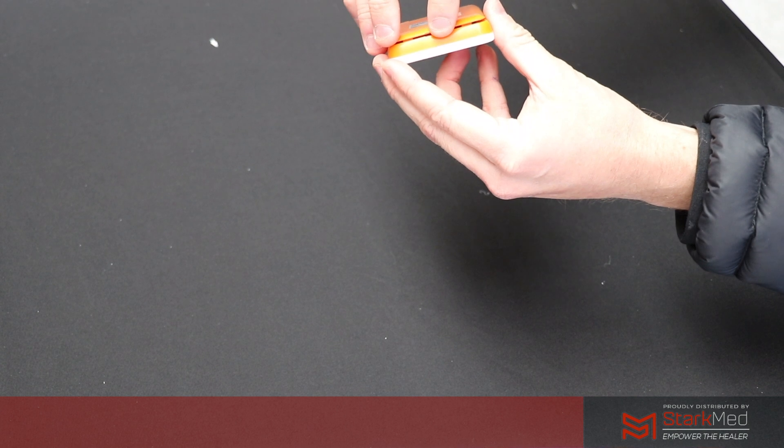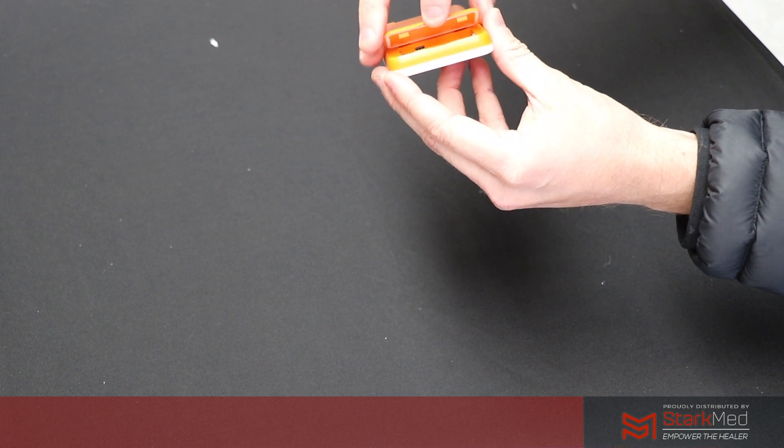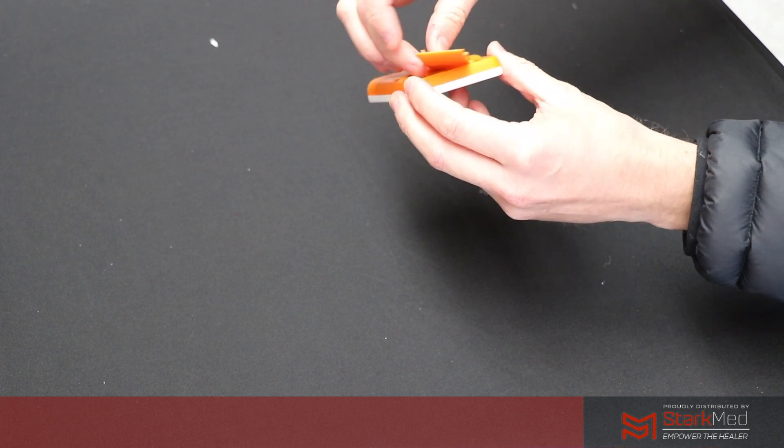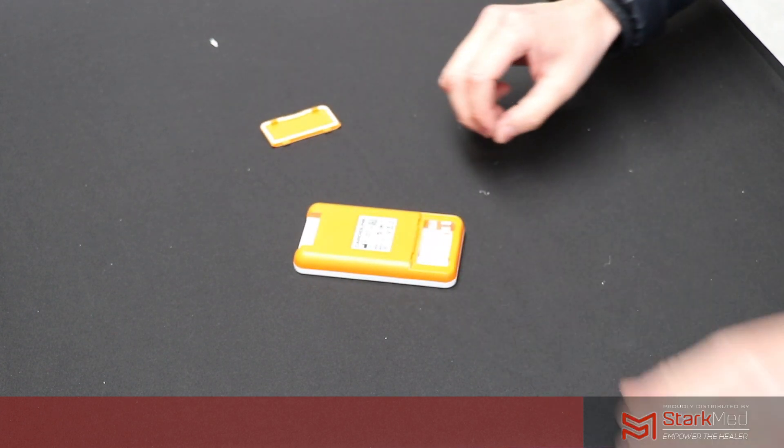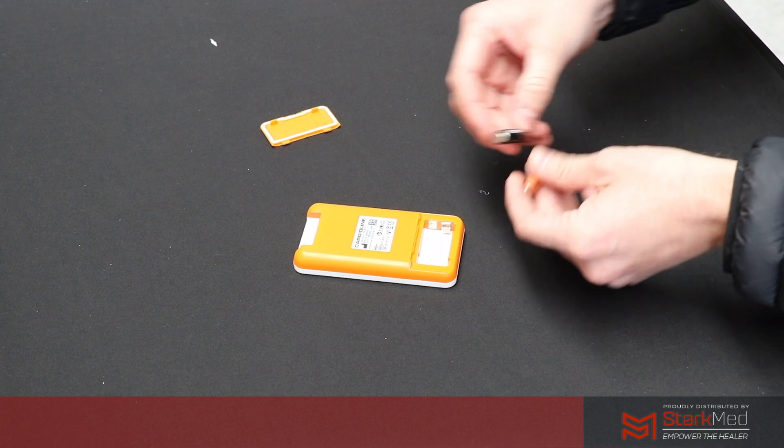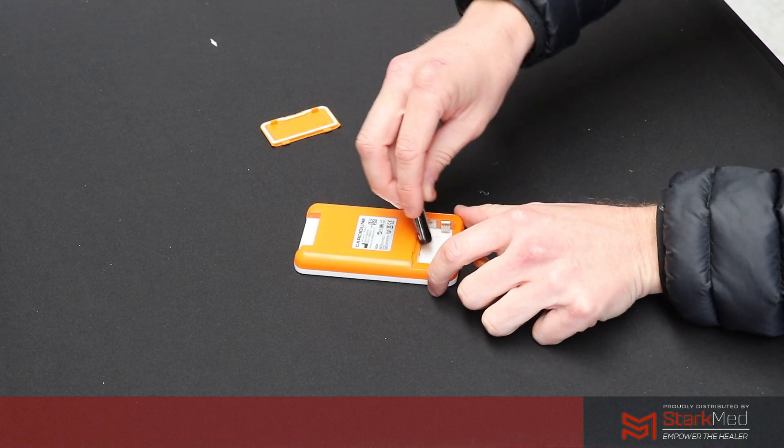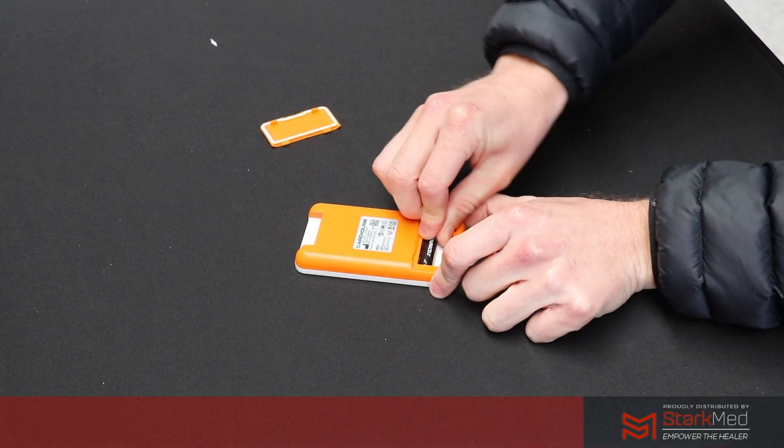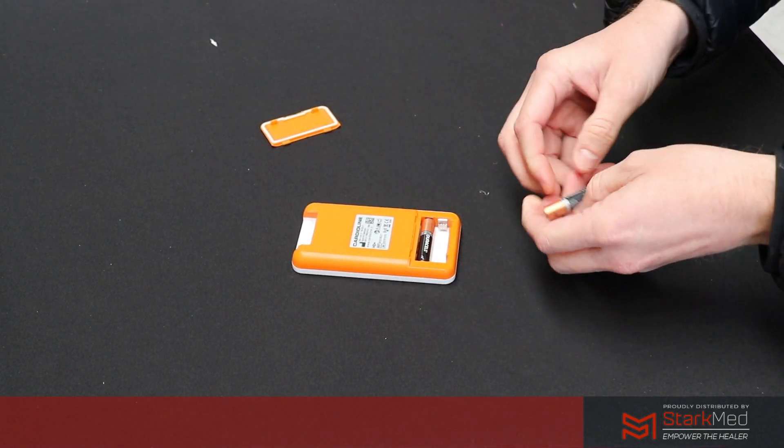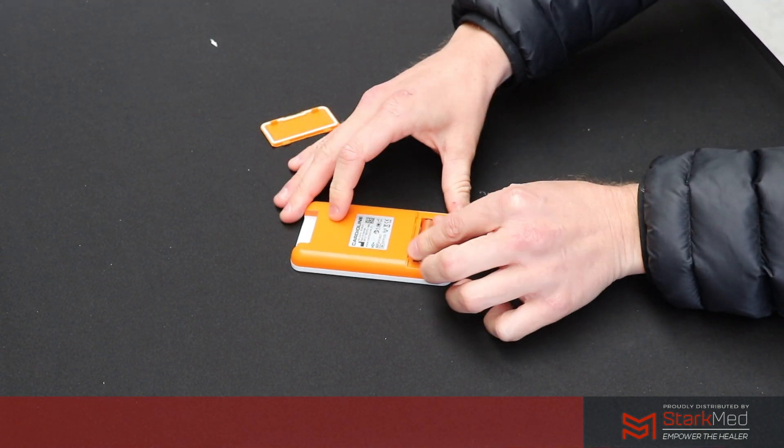Pretty simple and straightforward. We're just going to put the AAA batteries in and close the casing.